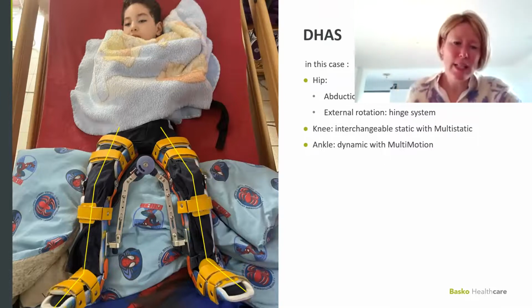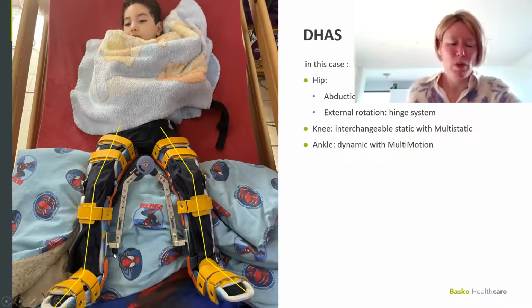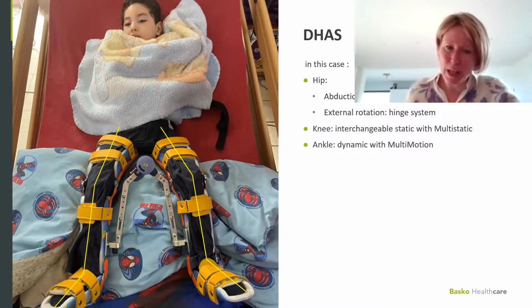You can just release the AFOs or the KFOs. You can just open it up by this little black button. And you just apply one KFO, then the other, and then you apply the system. So the only thing you really need to be aware of is the heels, and in this case, it is not beautifully presented. The PT, CPO, excuse me, the orthotist, could just apply here a beautiful square of polypropylene, just to let the heel slide onto a flat side.